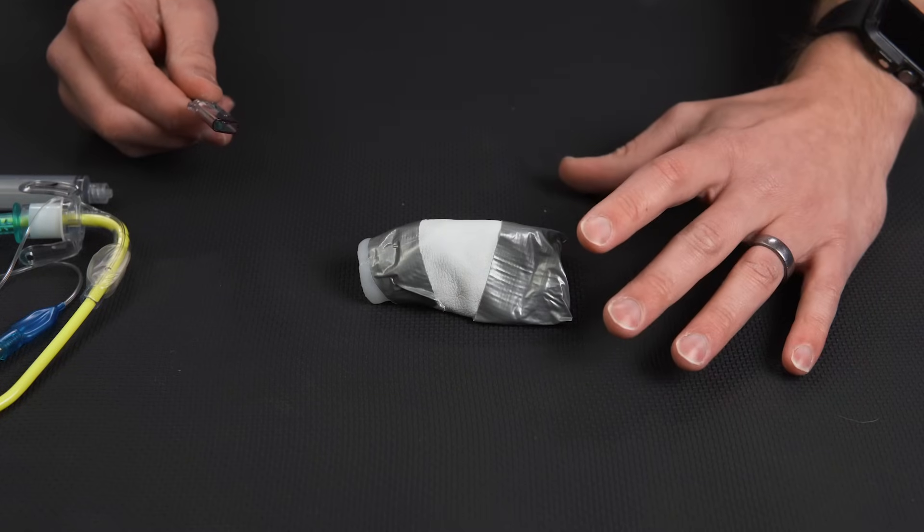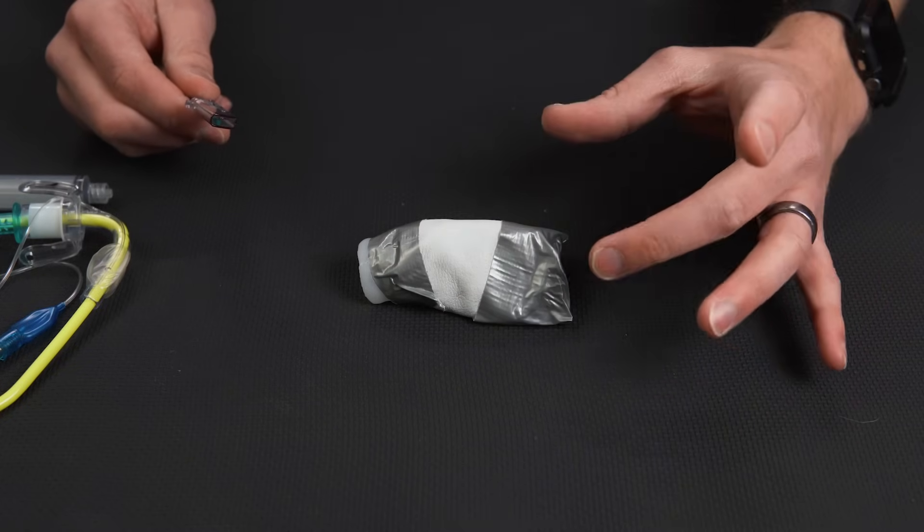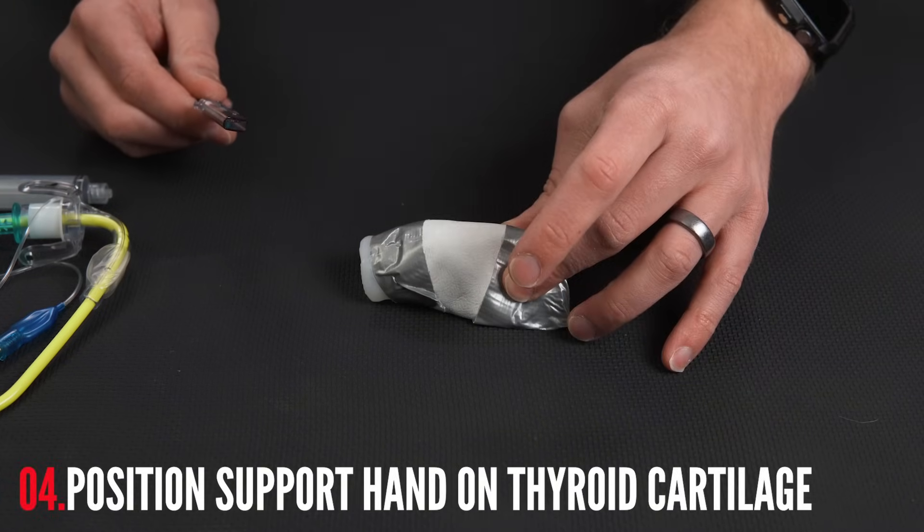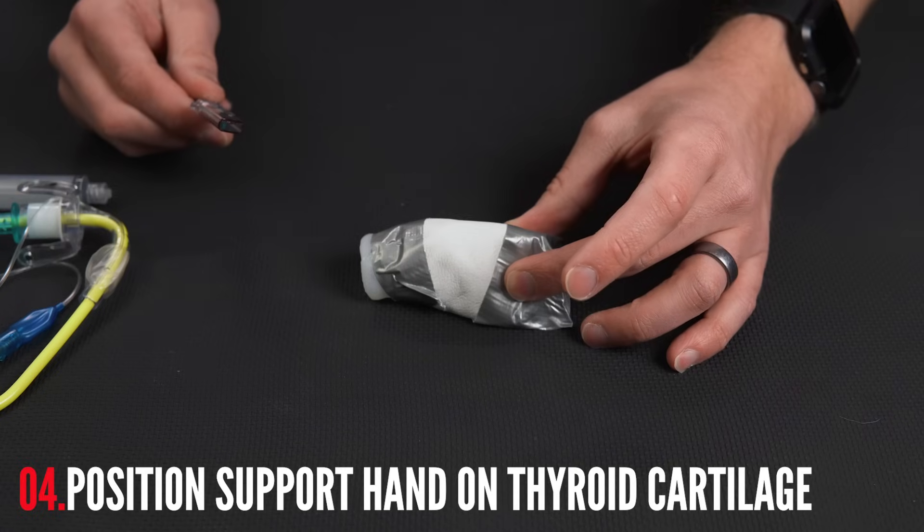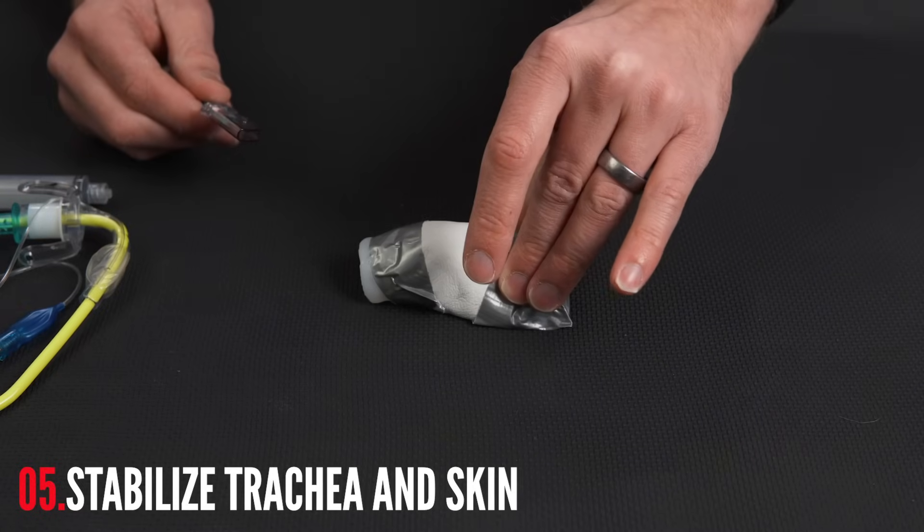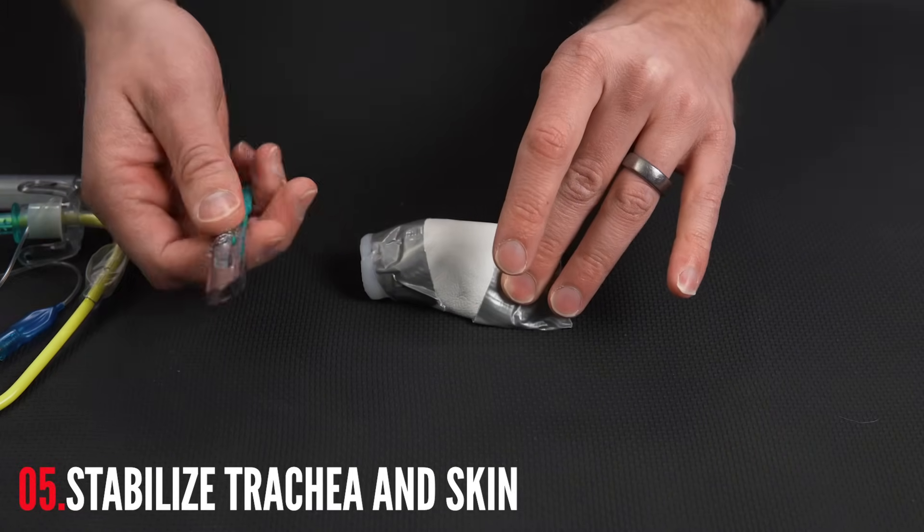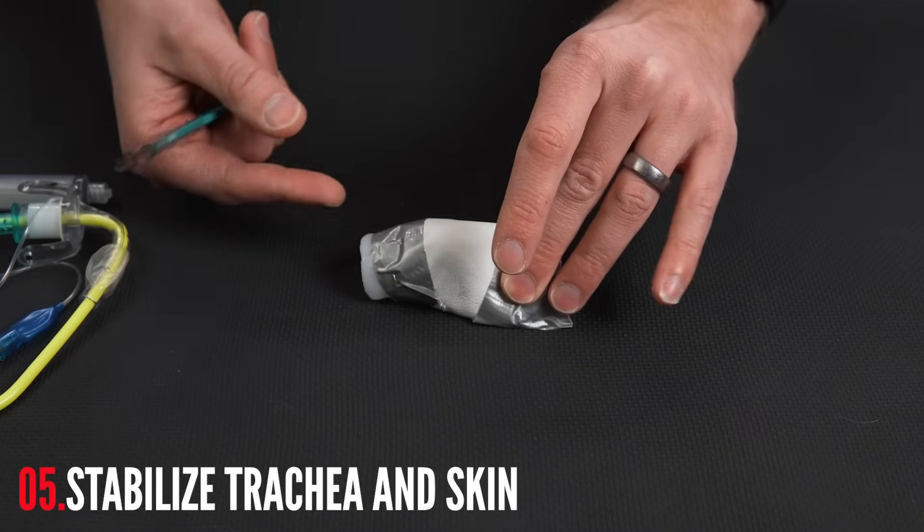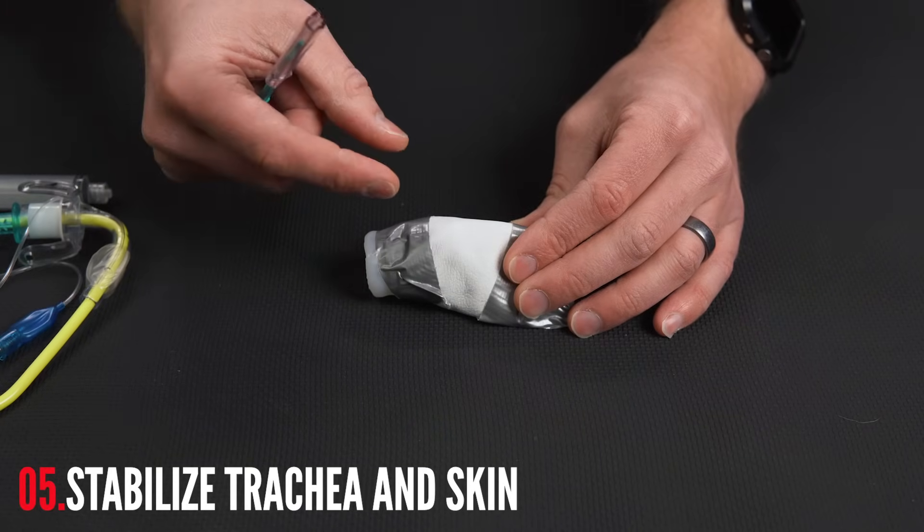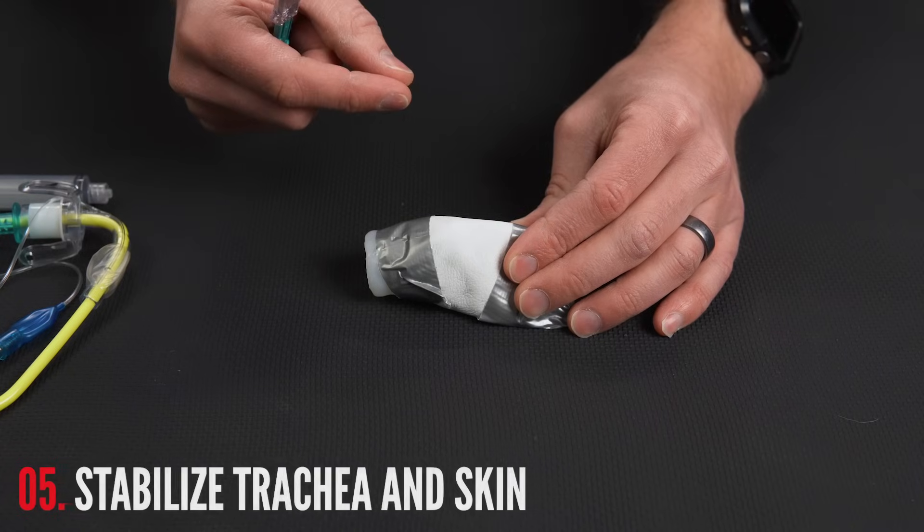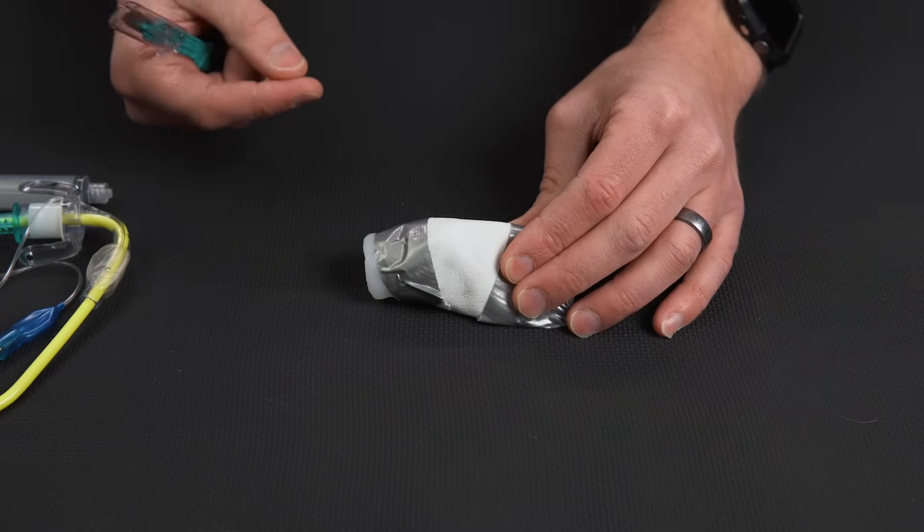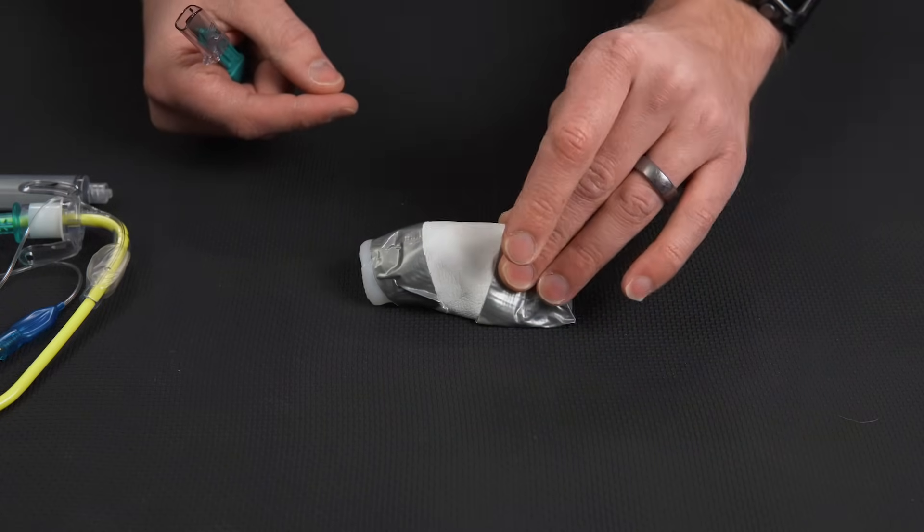So with my non-dominant hand, I'm going to take my middle finger and my thumb, and I'm going to find the actual thyroid cartilage. We're going to press down. This is to keep the skin and the trachea from moving irrespective of each other. It's dangerous when you create a cut through the skin, sometimes the trachea will move and you'll actually lose the hole you put in the cricothyroid membrane.